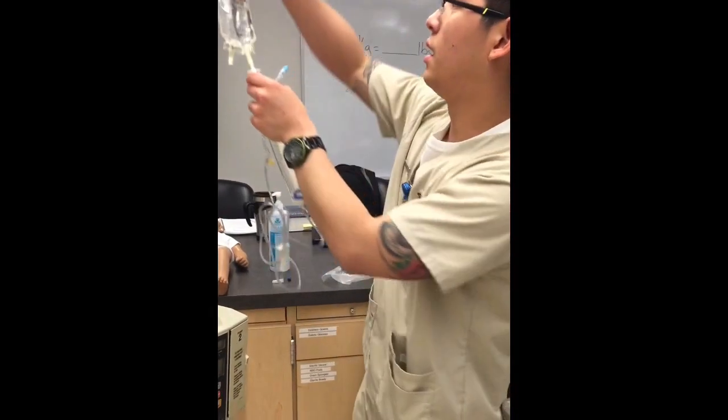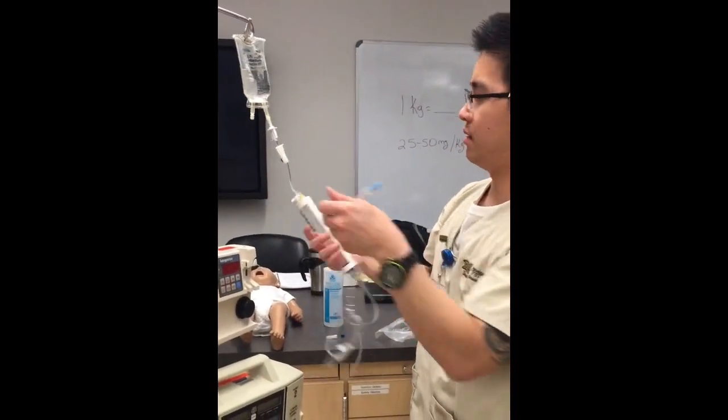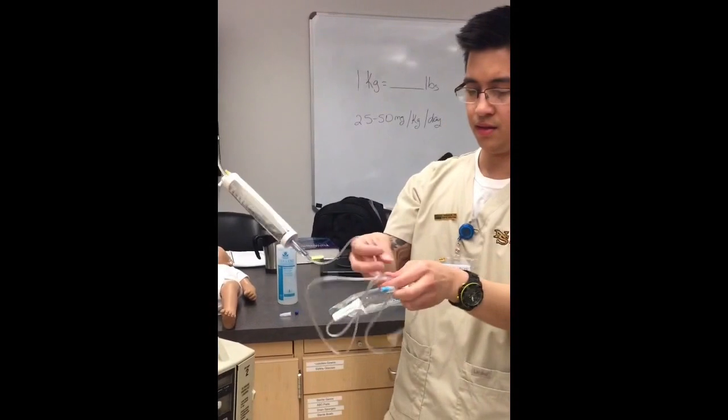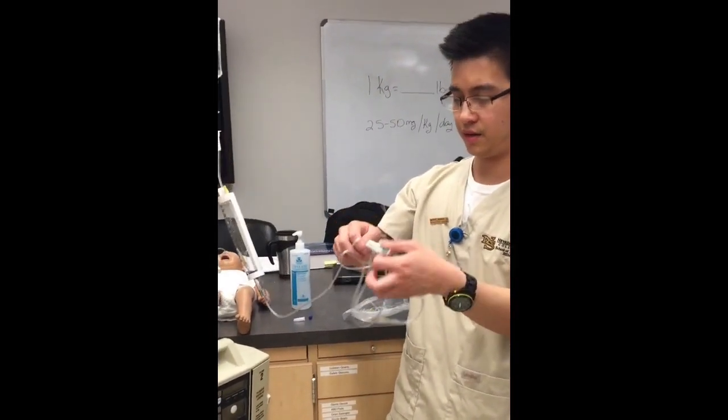Now that I'm in, I can hang this. Make sure you label your bag for the date, the time, the patient's name, and everything.